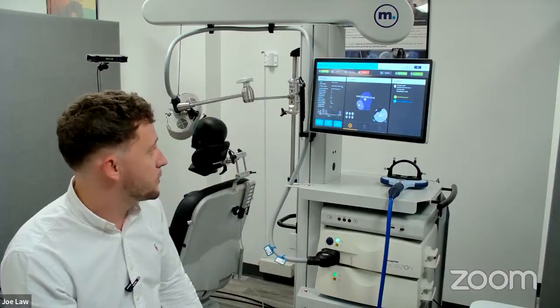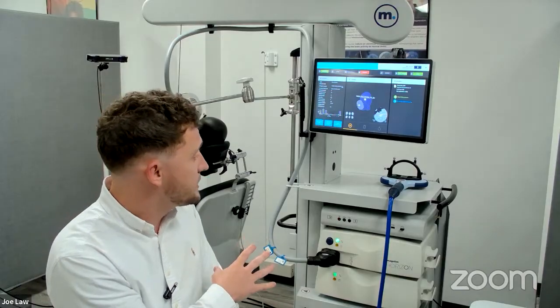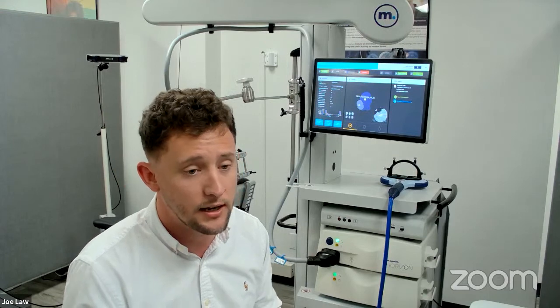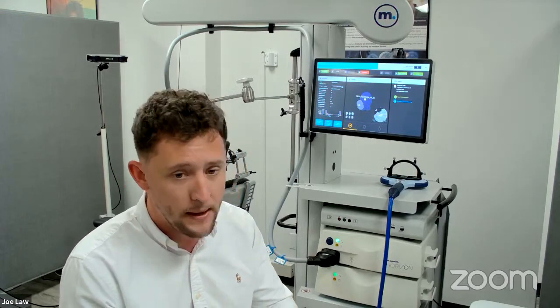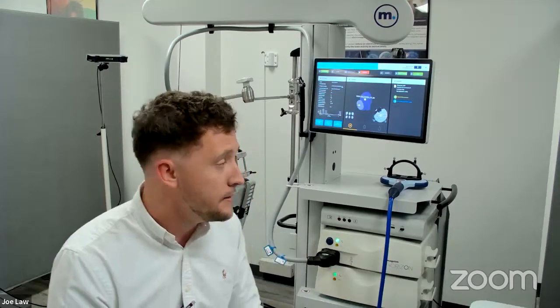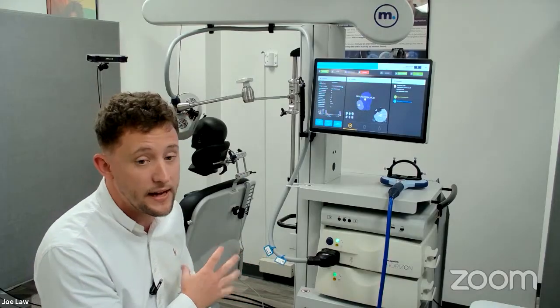So a couple of other things I just want to highlight about the system before I pass you back to Ronnie. The system is covered by a 2 year manufacturer's warranty. So that covers everything. That's repairs, replacements, if we need to visit the clinic, anything like that, there is no cost to the customer during the manufacturer's warranty. There's also an option to add extended warranty after this period. And then lastly, the system is included with installation.